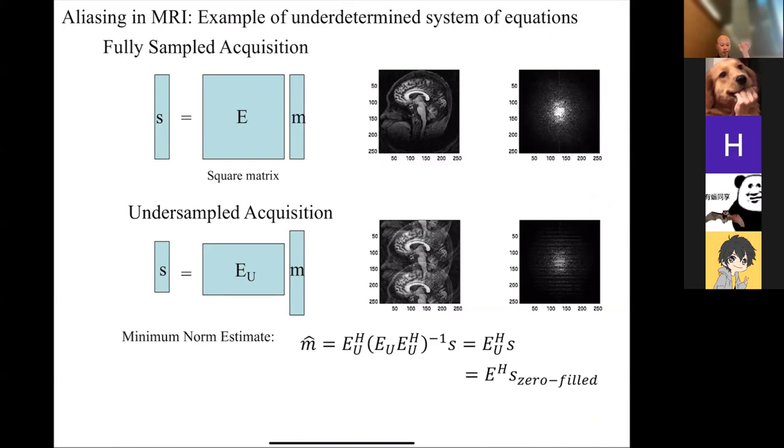And remember that space, as you saw in the homework, is going to be orthogonal to the null space of my encoding matrix. And what's in the null space? The null space is basically all those Fourier components I left out, including the Fourier component that would have a frequency like this, like a sine wave that would represent variation going one full cycle across my image. I don't have that Fourier component.